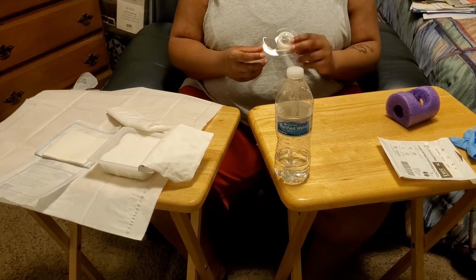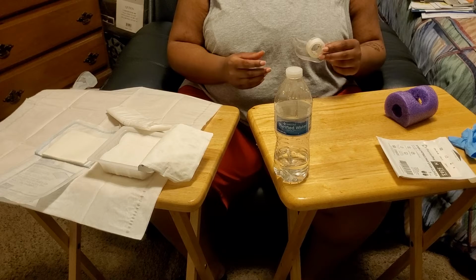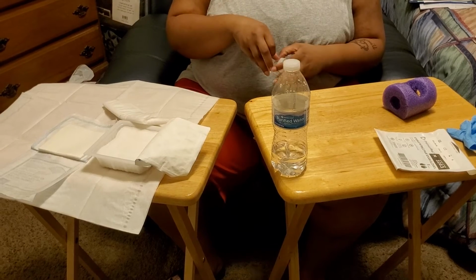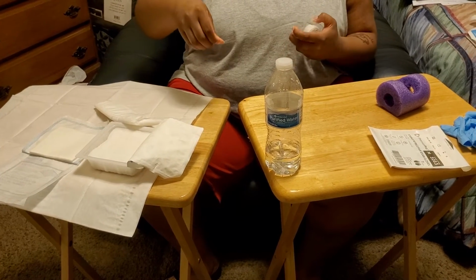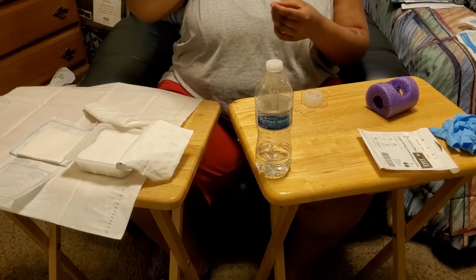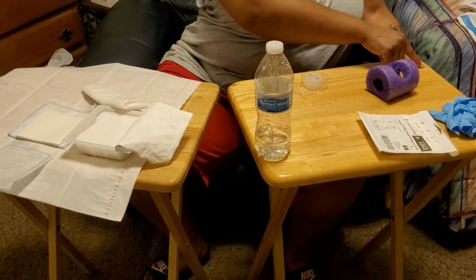I'm improvising and using Scotch tape, but it would actually be paper tape from the hospital. Okay, so I make sure that I'm getting 4 pieces of tape, like so, and placing them on the edge.